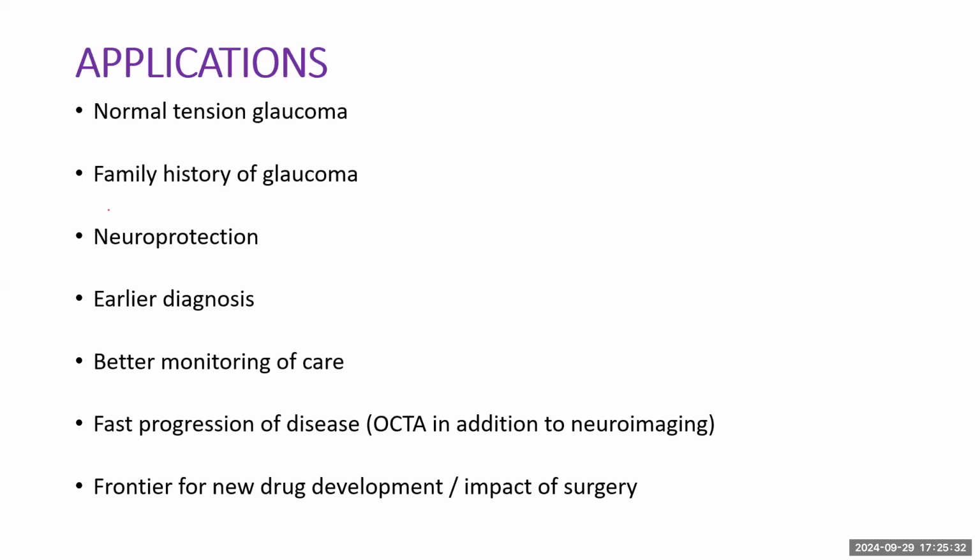So OCTA could be the new frontier for drug development and then impact of surgery. We never can tell whether trabeculectomy has an impact in increasing vessel density until we try out to see what the vessel density was before and after.